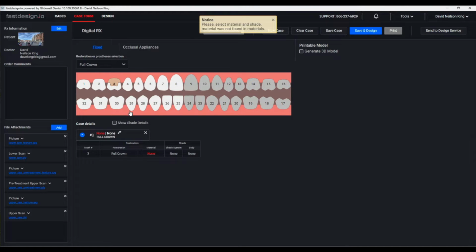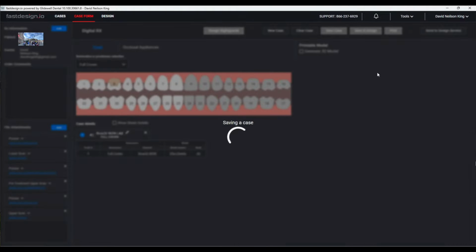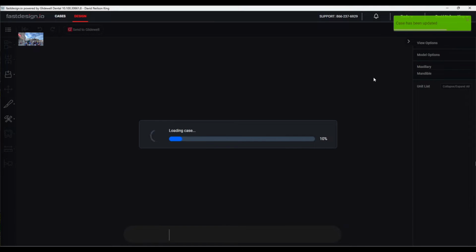So, Digital RX incomplete. Here's the crown. We're going to select the material, Bruxer now. Shade is an A2 block. That's out of the way. I'm going to hit Save and Design. It'll generate the initial models for me.